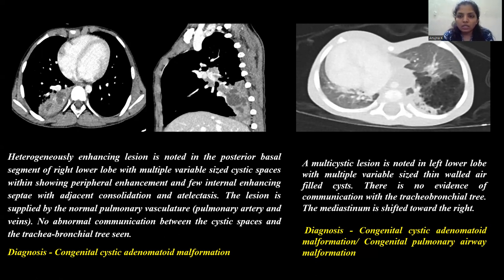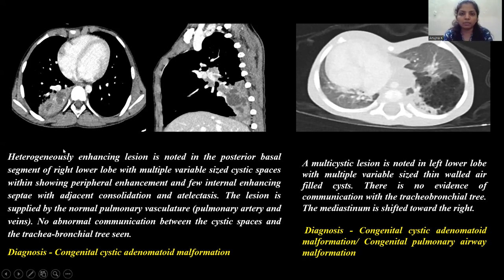The second image is an axial HRCT image showing a multicystic lesion in the left lower lobe with multiple variable-size thin-walled air-filled cysts. There is no evidence of communication with the tracheobronchial tree. The mediastinum is shifted towards the right. Diagnosis of congenital cystic adenomatoid malformation, or congenital pulmonary airway malformation, was made.